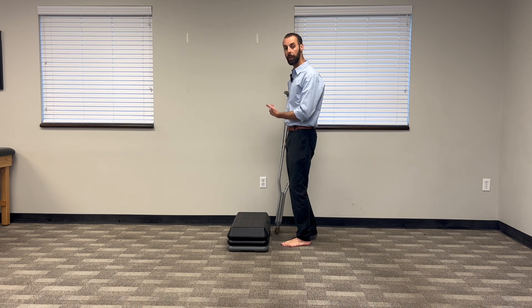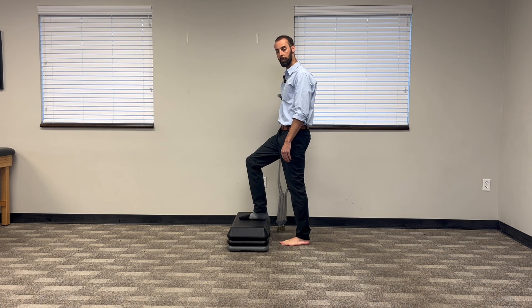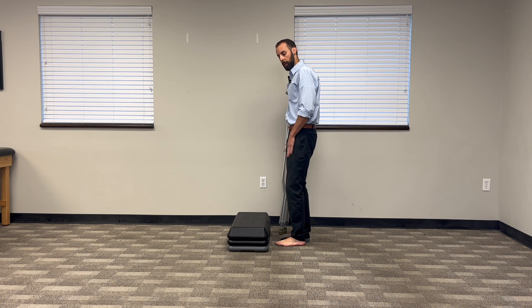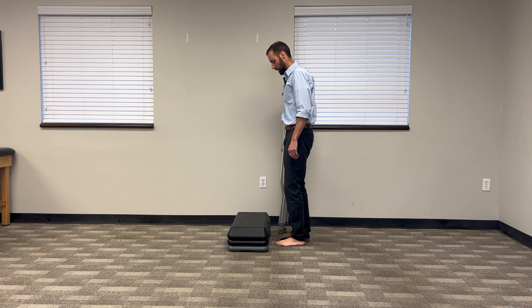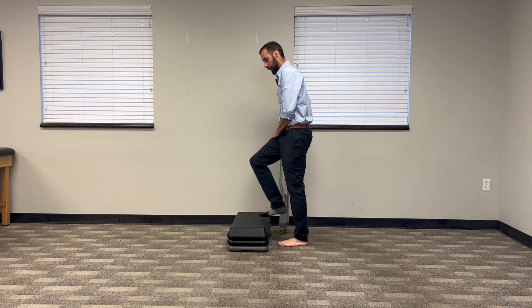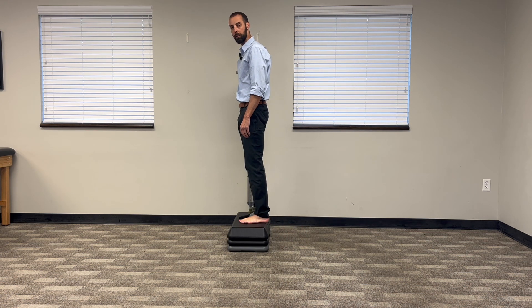When you're going up a step, your good foot is going to go up first. I'm going to support my weight — as much weight as you can put here and as much weight as you need to on your crutches. I just have both crutches in one hand, and I'm going to go up with my good leg and step up. Then my foot and the crutches come up together at the same time. Just like that.